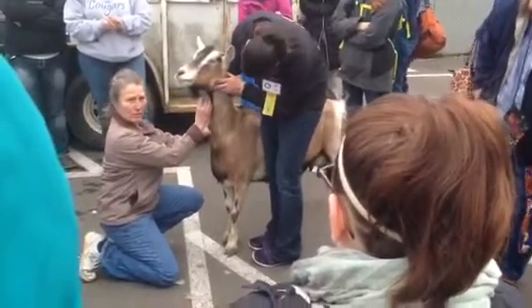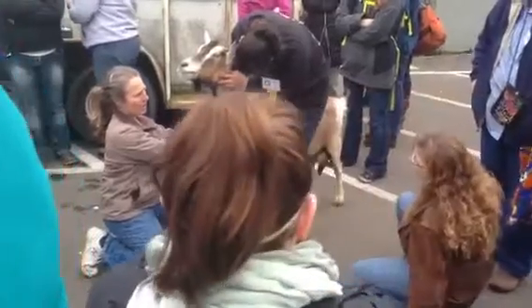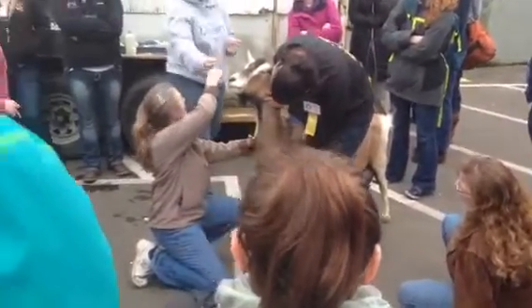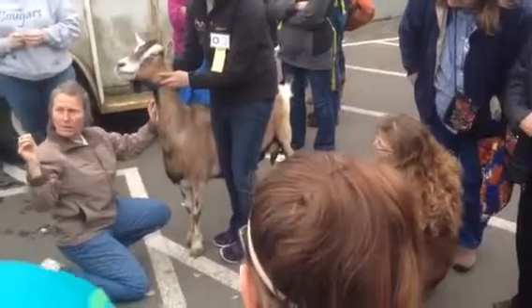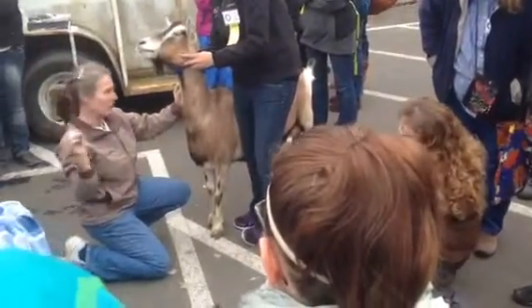Go ahead and make a needle poke first so you don't ruin your catheter. You're going down? Back it up a little bit. Going down. Now, pretend this is an 18 gauge needle and pretend I have suture — any kind of suture that will fit through an 18 gauge needle. Don't care what it is.